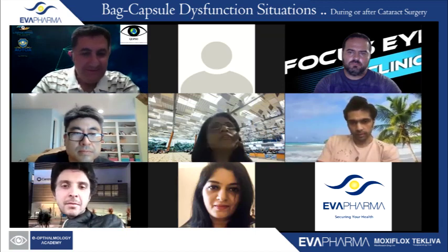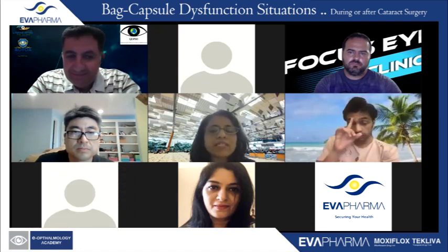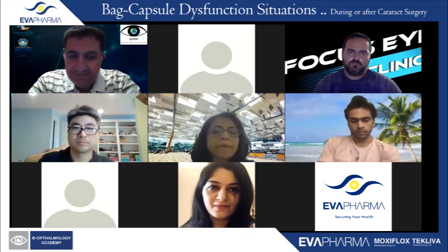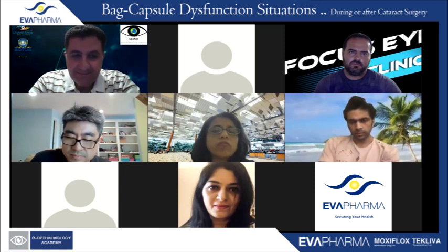Yeah, that's a good question, Ashraf. So basically, this all comes in as part of the discussion that I said that we could have on phimosis. You know, what happens if phimosis develops? So what you can do to prevent phimosis is one of the things that you said. You could either do intraoperative a PCCC, as seen in the second case, along with some relaxing cuts on the anterior capsule.